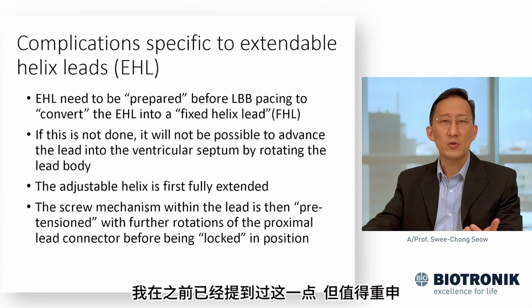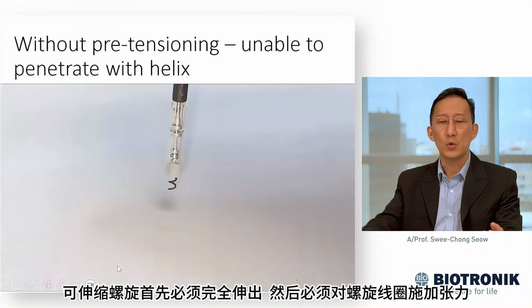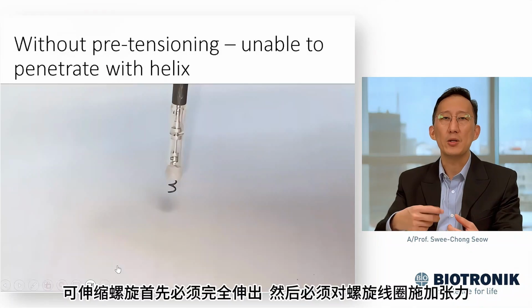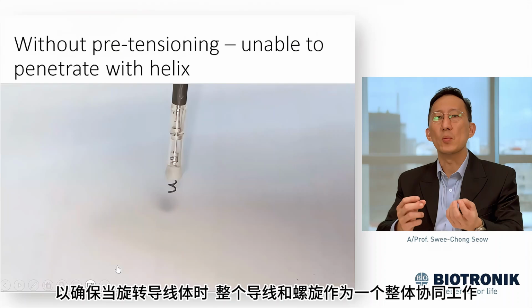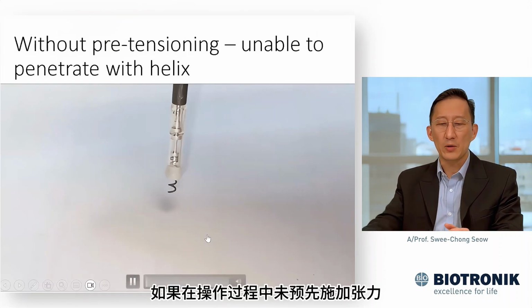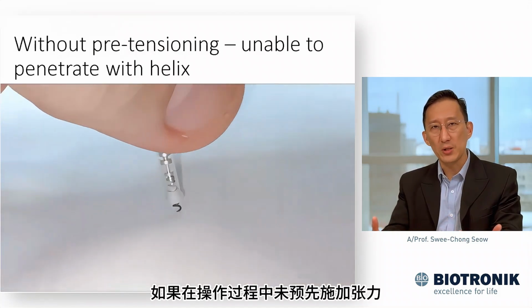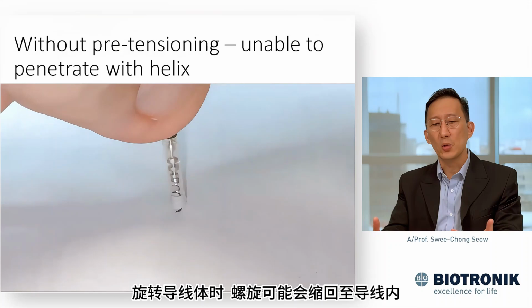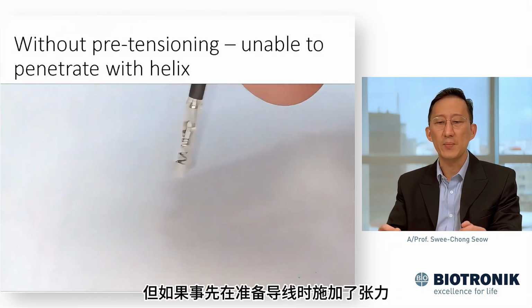So I've talked about this in my earlier talk, but it bears repetition that the adjustable helix has to first be extended, and then the screw mechanism has to be pre-tensioned to allow the whole lead and helix to move as one unit when you rotate the lead body. So I showed this in my earlier talk as well, that if you do not do this pre-tensioning maneuver, your helix gets retracted into the housing when you rotate the lead body.